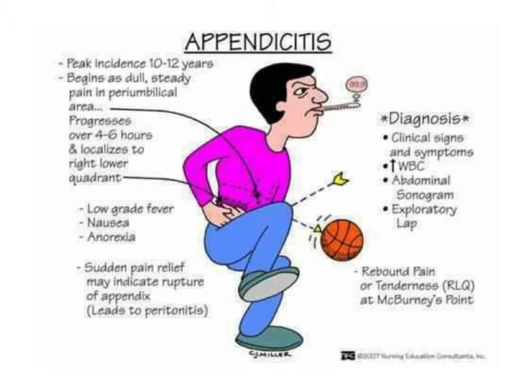Even if that is a fat boy, it doesn't matter, because we can use an abdominal probe or linear probe to scan the abdomen. I can even use the abdominal probe and linear probe to scan appendicitis in an adult patient. So it will be much easier to scan pediatric appendicitis compared to the adult, right?